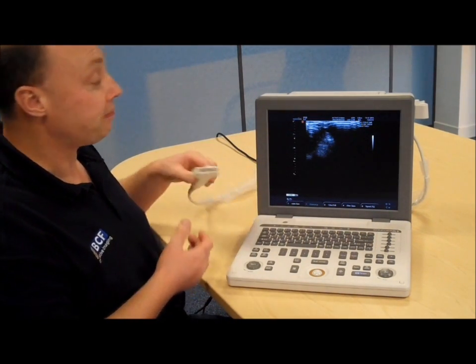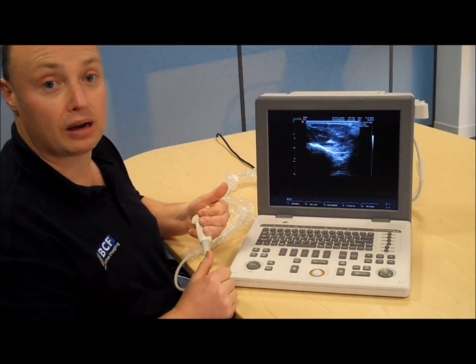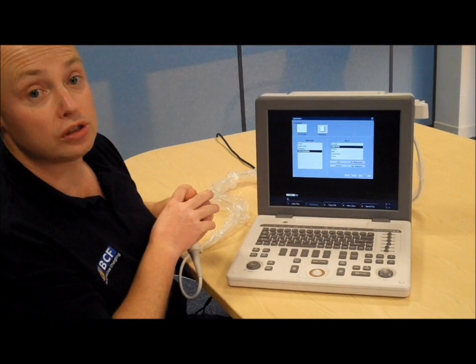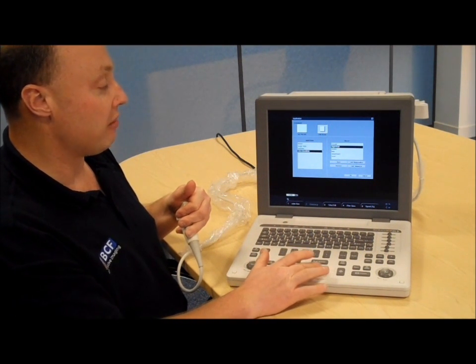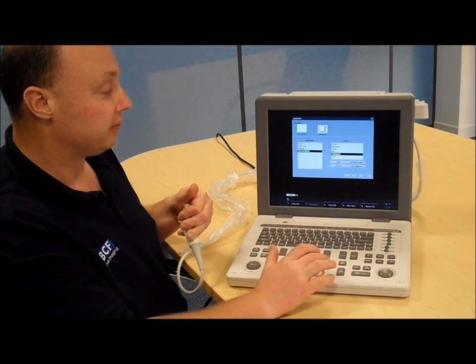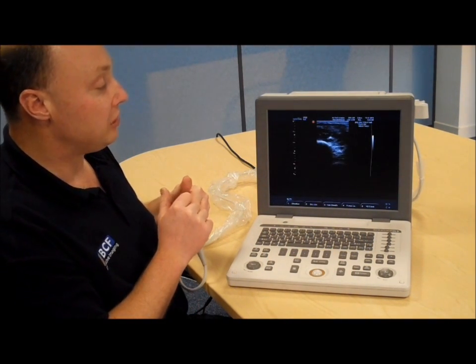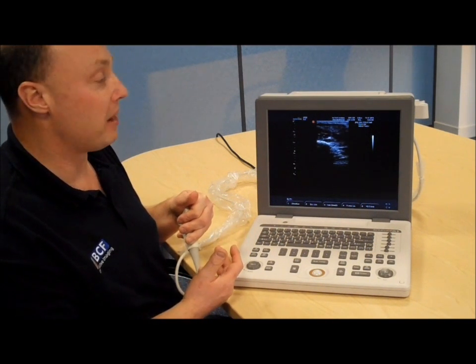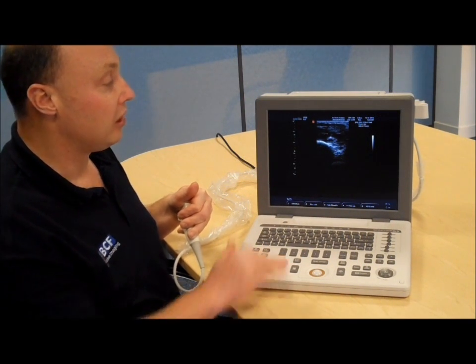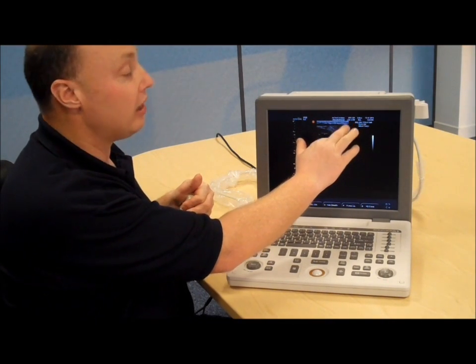You are now ready to scan. Take your transducer and you can start to scan as you like. The very first thing you have to do when you start scanning is come to your applications button and choose what you're going to scan. This time we're using the musculoskeletal program and we're going to choose to scan the suspensory. Choose the suspensory and then hit OK. This now sets the scanner up appropriately for scanning the suspensory. We've done all the hard work getting all these presets and programs set up. You can see we're on the musculoskeletal program, using the 5 to 12 megahertz 40 millimeter probe.